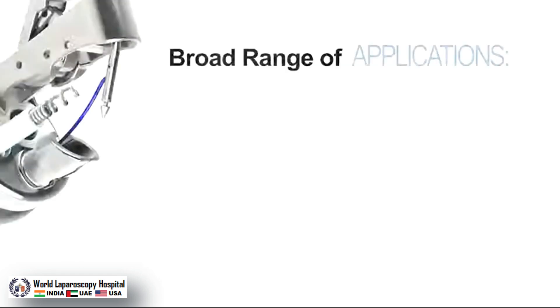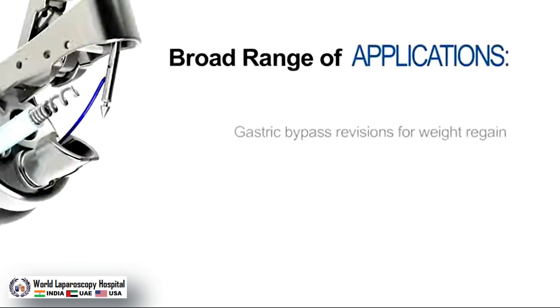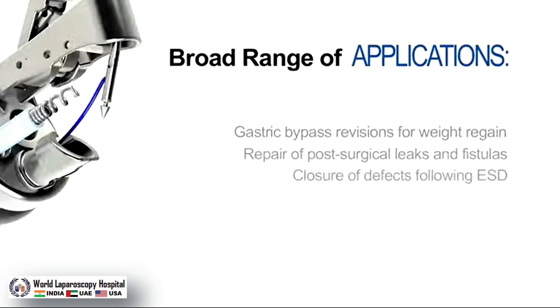Its broad range of applications includes gastric bypass revision for weight management, repair of post-surgical leaks and fistulas, closure of defects following ESD, and many more.